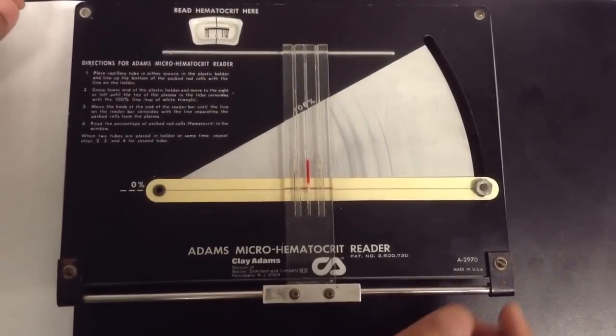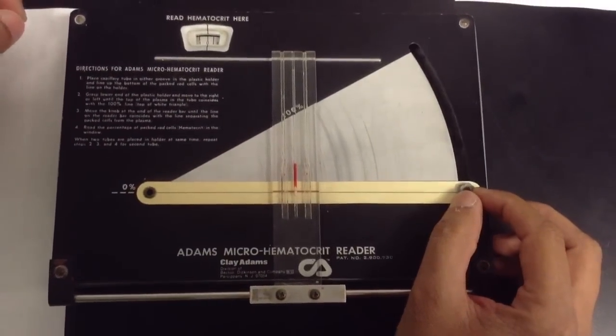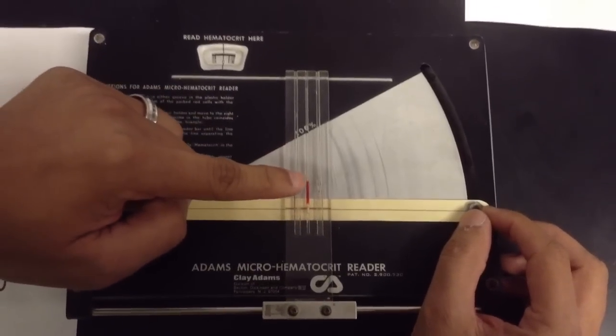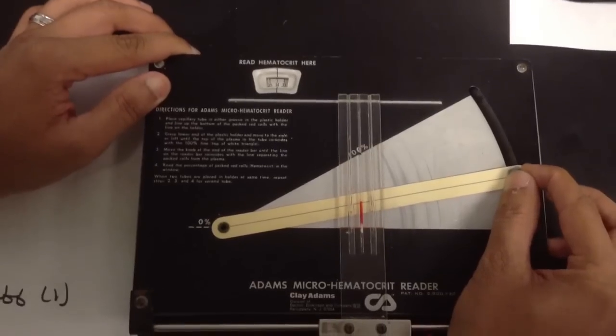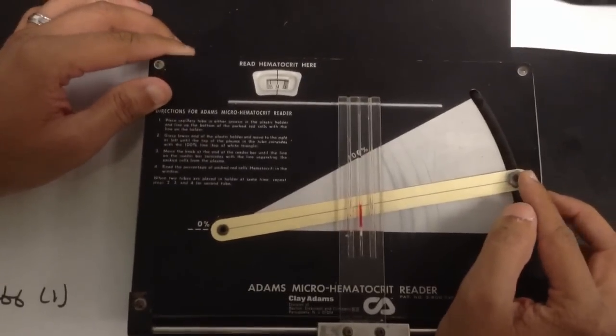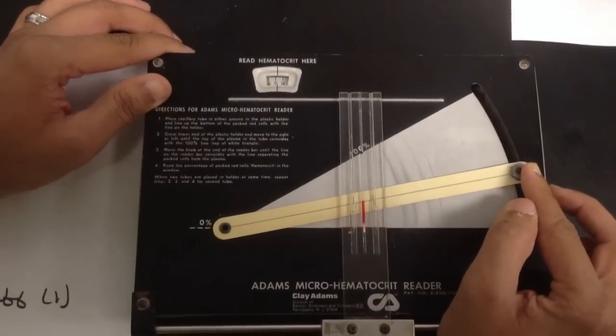So it touched the 100% line, you take this level right here and move it towards the hematocrit level or the blood level. So it's at the hematocrit right here. And you see the measurement perfectly.